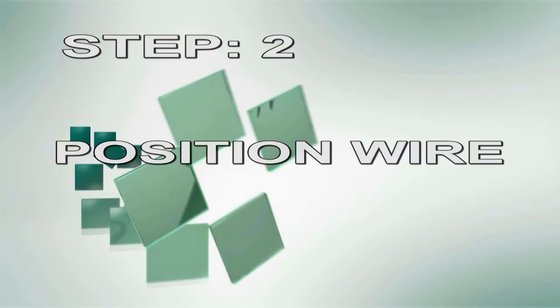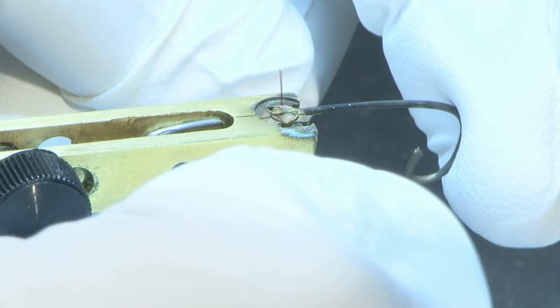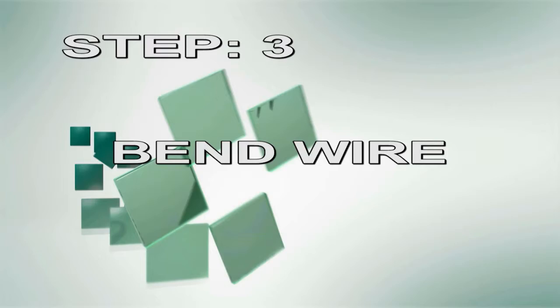Step 2. Position wire. Now place the leading end of the wire on the ring holding fixture using the piano wire.